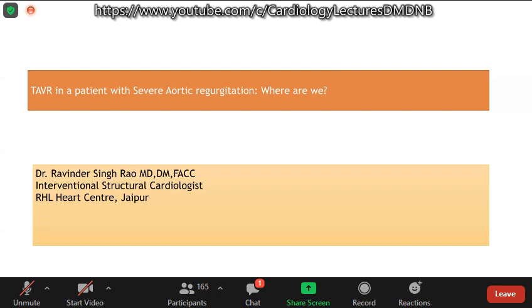That was a great talk by Dr. Segitis, and he showed some really excellent cases. So congratulations to him from my side. And in all his cases, the deployment and the implantation was right on spot. And this is how we started the first in man case, and we took it forward that the implantation has to be very high in order to avoid the pacemaker rate.